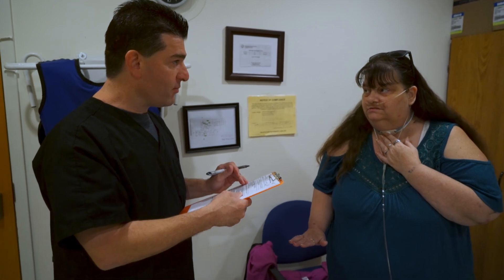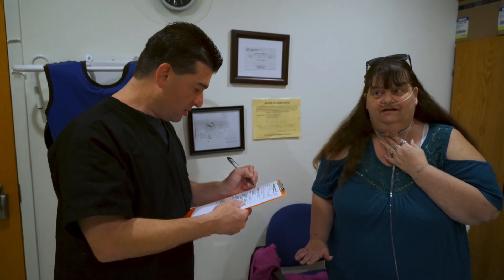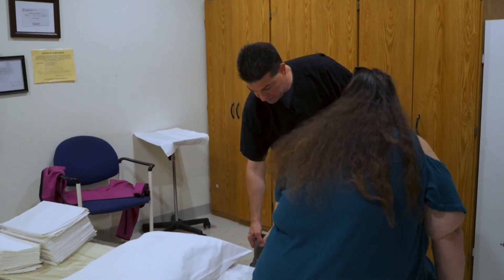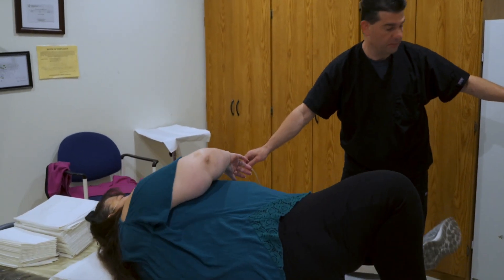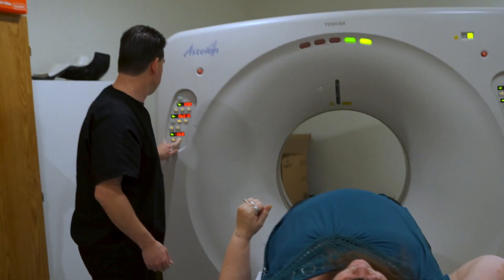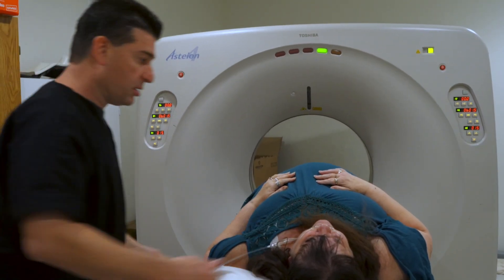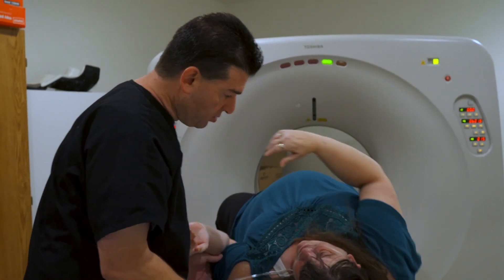Just as long as I don't have to lay completely flat. You have to lay completely flat, but it won't be long. I don't know if I can handle it. I'm sorry, we'll try to make this as quick as we can. I can put that right there.